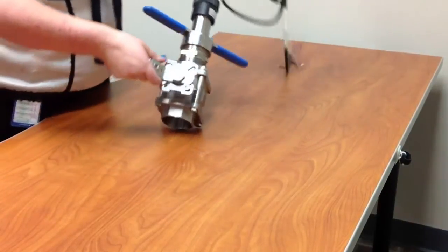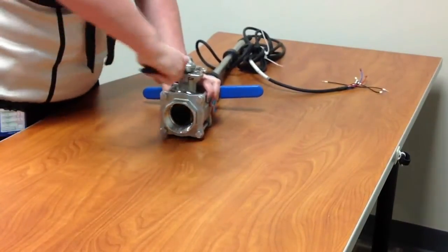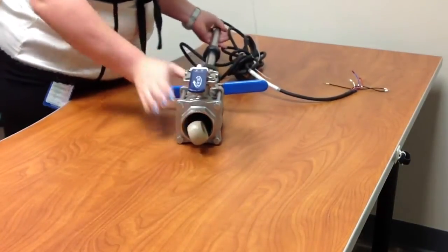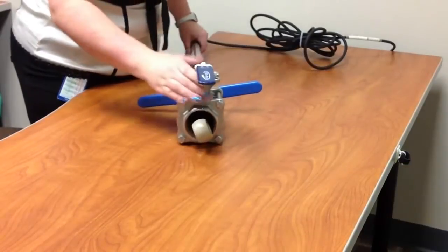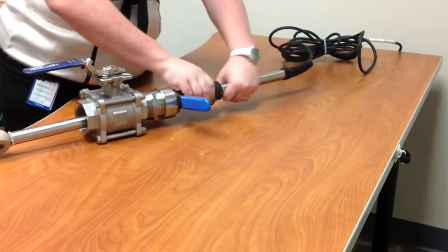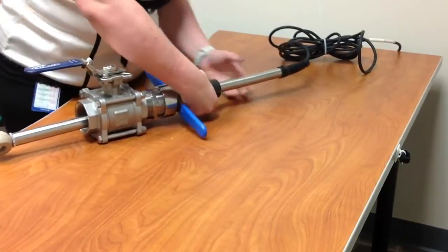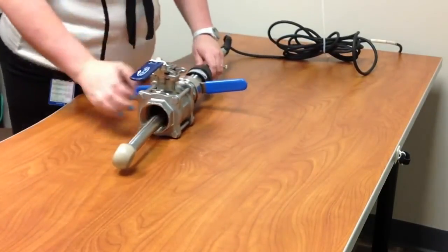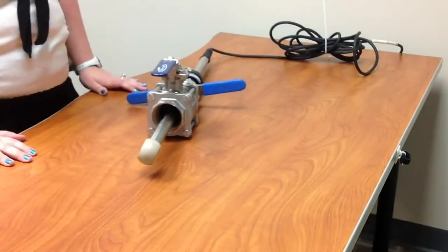you can then open your ball valve, push your PR-10 assembly into your process to your max insertion depth, and then you'll take the locking screw and lock it. Then tighten it into place, and that basically keeps your PR-10 so it can't go out any further. And that's your installation.